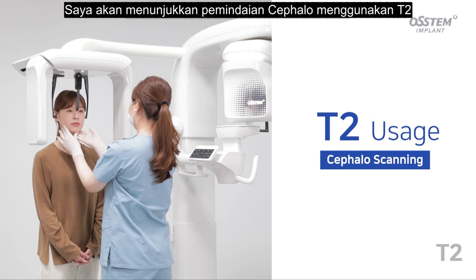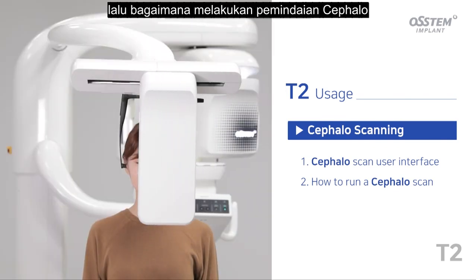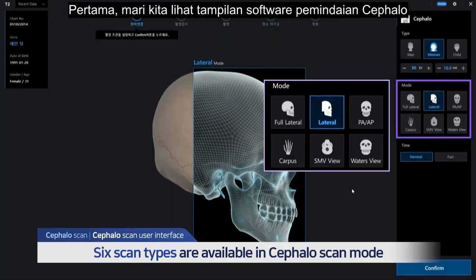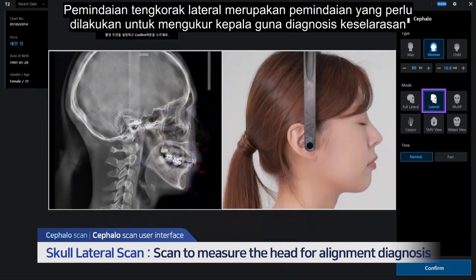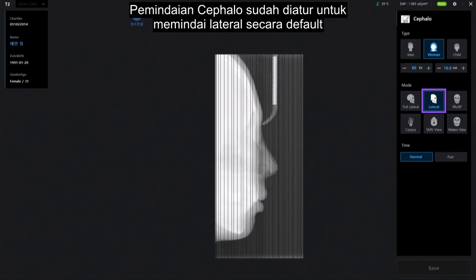Let me show you how to run a cephalo scan using the T2. First, we'll be looking at the cephalo scan user interface, and then how to run a cephalo scan. First, let's take a look at cephalo scan user interface. There are 6 scan types available in cephalo scan mode. A skull lateral scan is a major scan required to measure the head for alignment diagnosis. It helps observe any changes in the face. Cephalo scan is set to lateral scan by default.